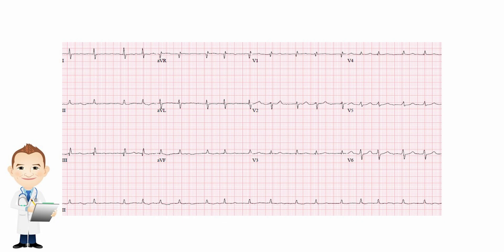You are looking at a rhythm that isn't that fast. If you count it up, it's not unusually tachycardic, but you don't see P waves before every QRS, and not every QRS follows a P wave. You actually don't see P waves at all, and it's irregular.